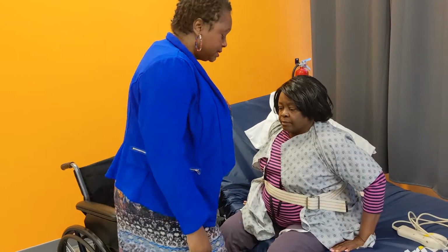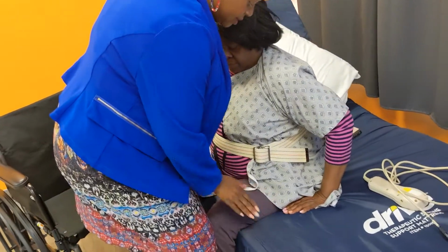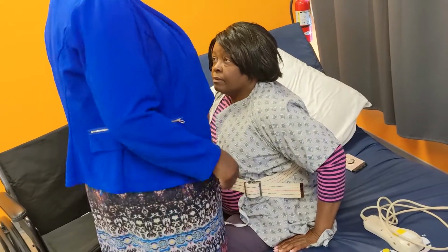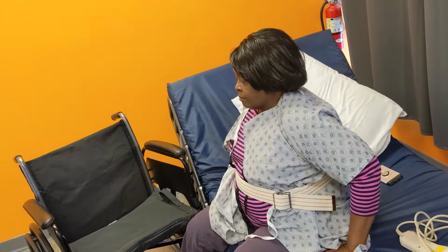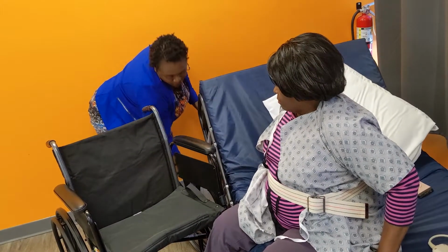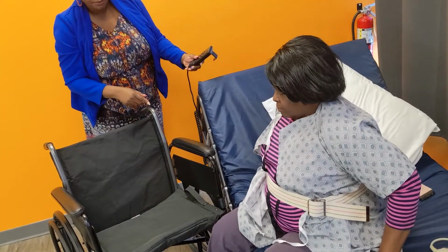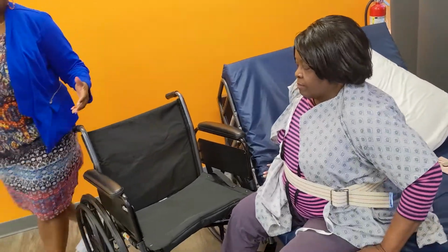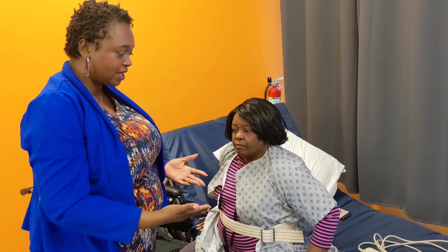Okay, so what I'm going to do, I come close to the patient. It's knee, the patient's knee, and my knee. And I'm actually going to squat down. And honestly, with this bed, because this lovely patient's a little bit taller, you could actually raise the bed. That's why you have to see the patient's body mechanics. Plant your feet on the ground, scooch up and plant your feet on the ground. Good, good, good, good. If the patient's taller, do you see you could raise the bed a little bit so you don't have to squat that low.